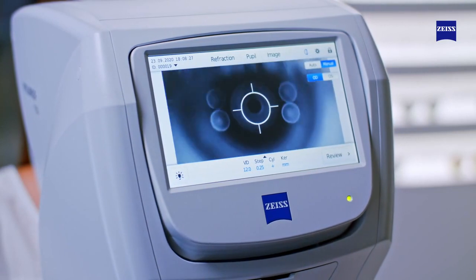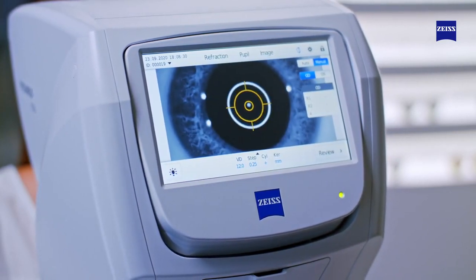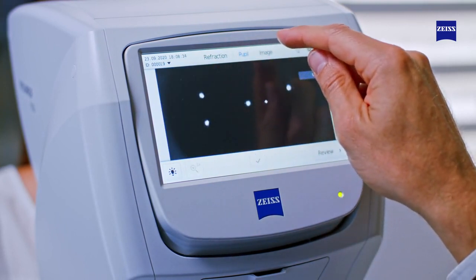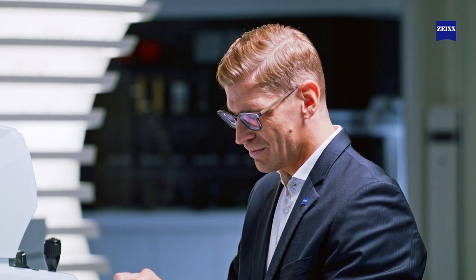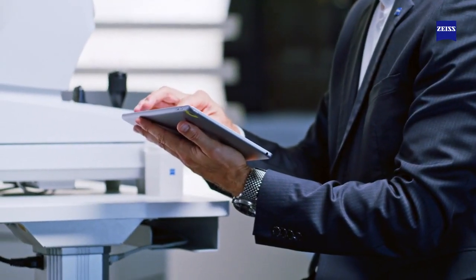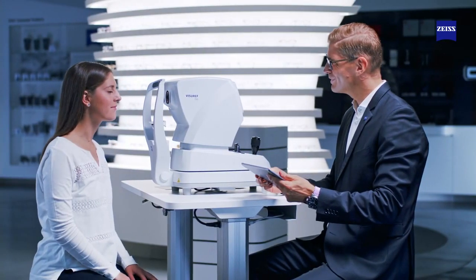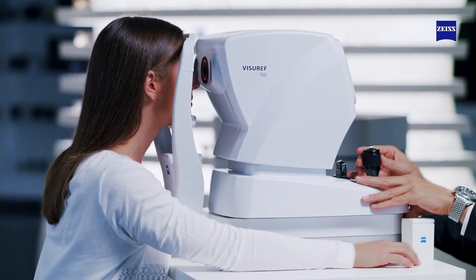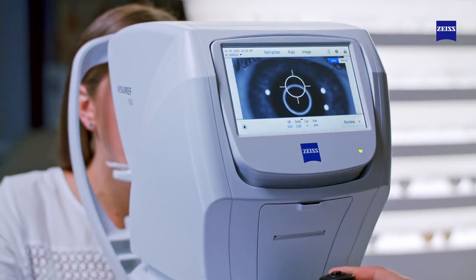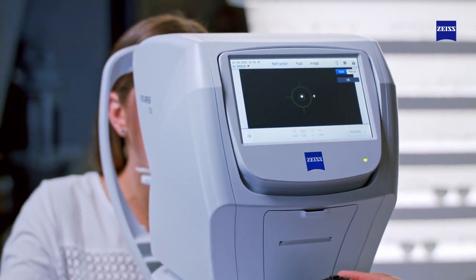With its modern and intuitive user interface, the combined auto refractor keratometer gives you quick access to the most common output parameters. The enhanced connectivity of the Zeiss Visu REF 150 via Zeiss Visu Consult 500 makes your daily routines even more efficient. Measurements are conducted easily using the touchscreen and joystick, and diagnostic information is displayed clearly on the adjustable color touch monitor.